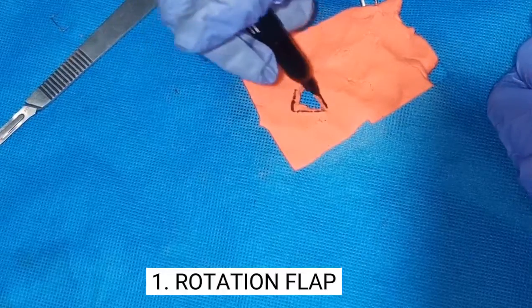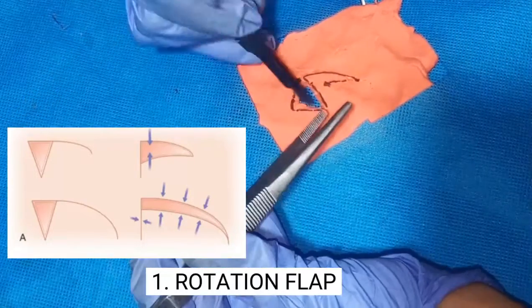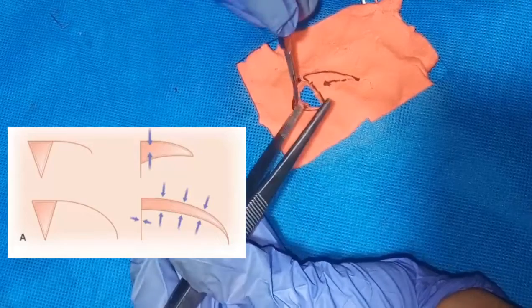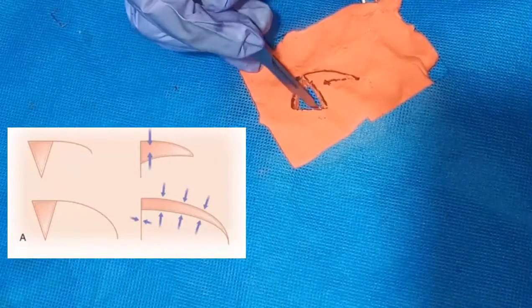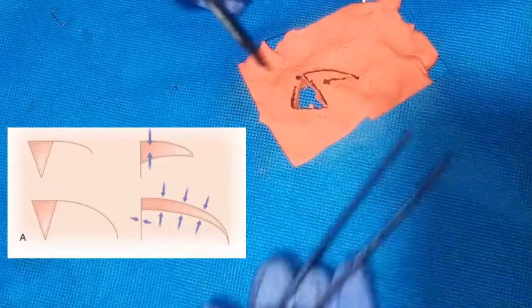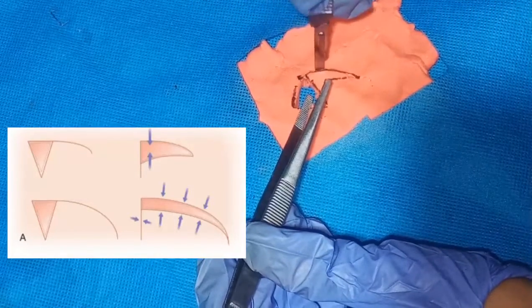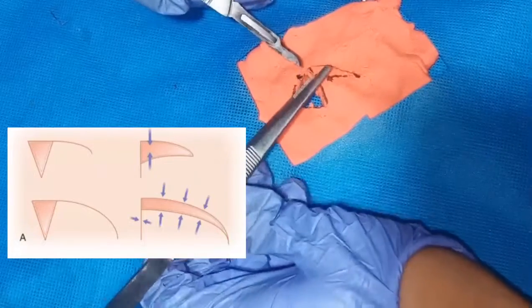So a curved incision is begun adjacent to the shortest side of the triangular wound. The incision is gradually lengthened and the flap undermined until it is of sufficient length to cover the wound without tension. Here we are removing the epithelialized portion of the granulation bed by sharp dissection, followed by undermining the skin attachment to free up the bordering skin.